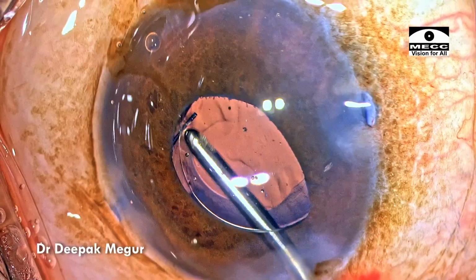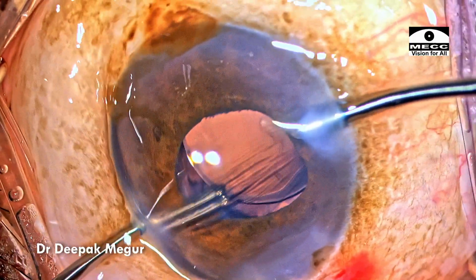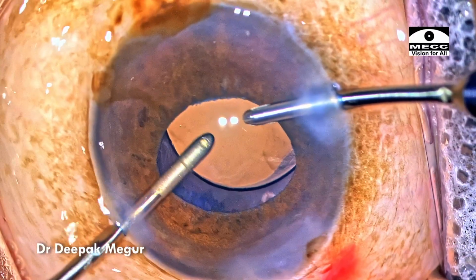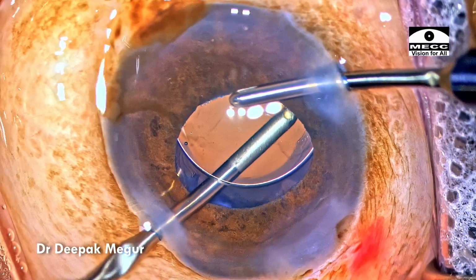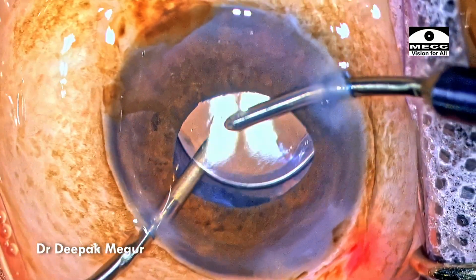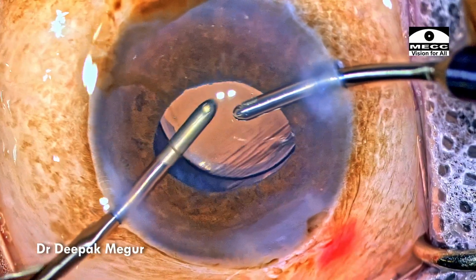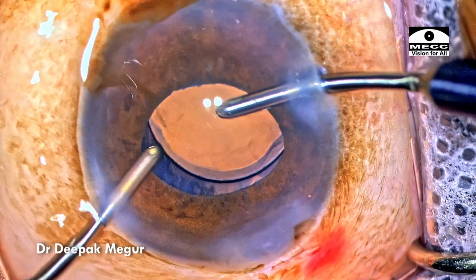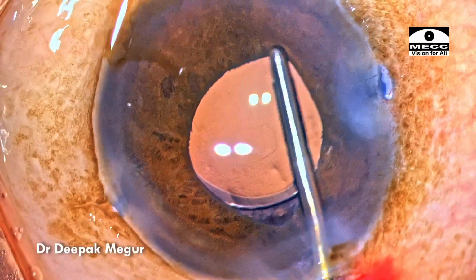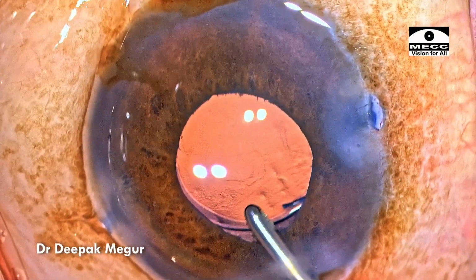Now is the time to remove the OVD behind the lens. The lens is tilted up, and using the bimanual I&A, the cohesive OVD behind the lens is being aspirated out using the aspiration cannula under the lens. We need to be careful not to engage the posterior capsule during this maneuver. And once the OVD both in front and behind are removed, it is time to achieve the optic capture.